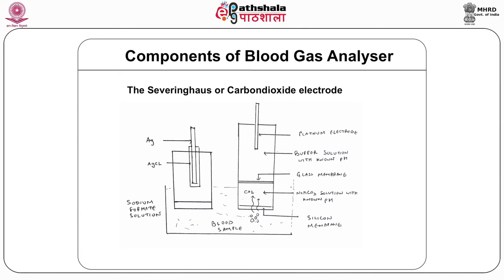The argument given by the editor was that the oxygen tension in the blood that was coming out from the device could not be measured. This affected him emotionally. He then decided to develop a device that can measure the oxygen tension in the blood. Thus, this device was invented. The contribution of this device in modern medicine is enormous, as innumerable lives have been saved, and it will be fun to know how it works with further discussion.